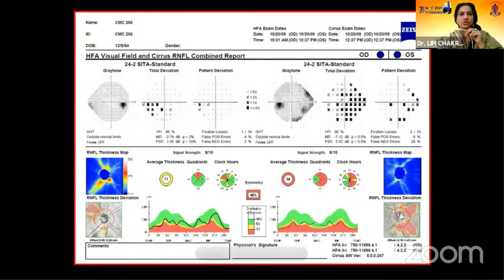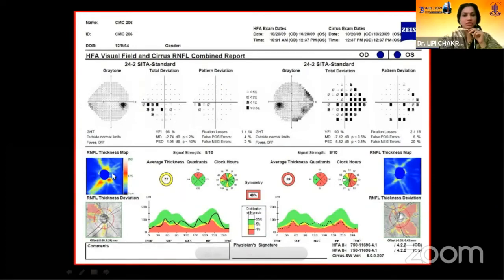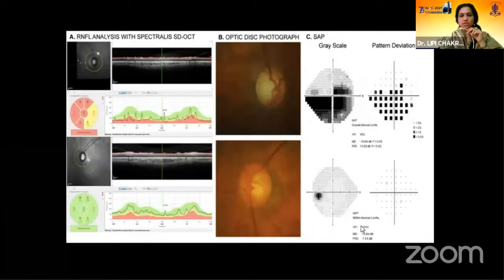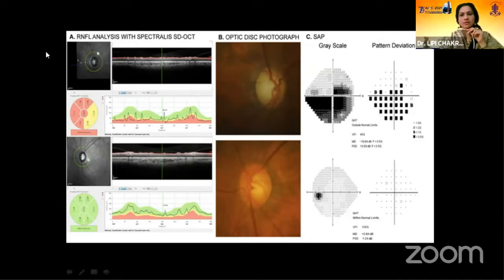This is the HFA visual fields and Spectralis RNFL combined report. For example, if it's a case having inferior scotomas, the corresponding superior RNFL defect can be seen in the thickness map, thickness deviation map, and in the curve or graph. Similarly, in the left eye, we are finding moderate to advanced glaucoma with lots of scotomas, and we find red zones in the OCT also. There are minor differences between all three types of OCT, but nothing major.